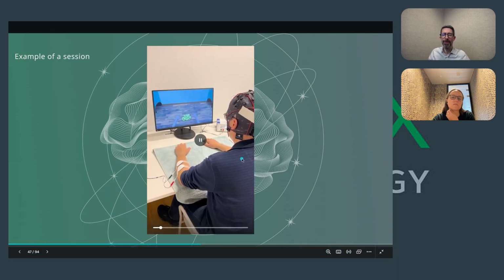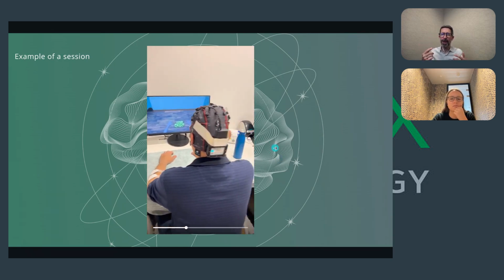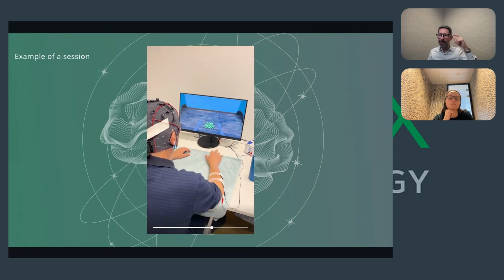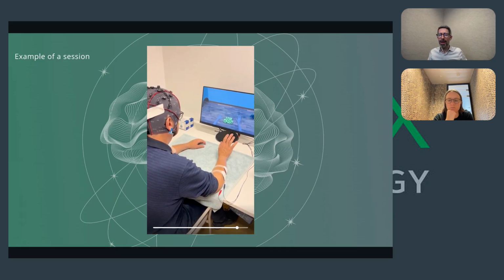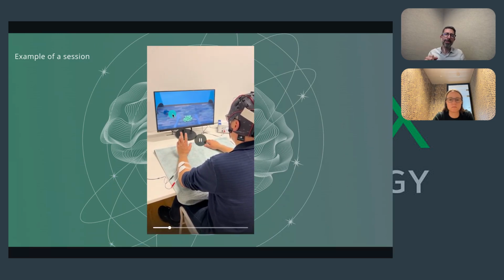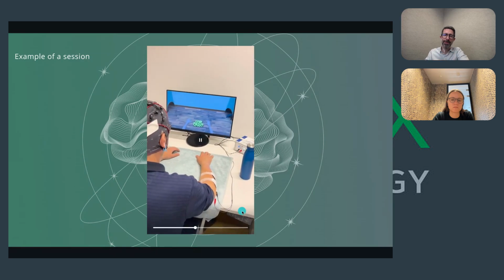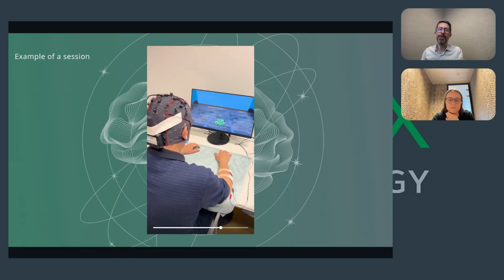When we hear left, we have a second or two of reaction time, as when we drive a car, where we're like, huh? What? Which side? What is it I'm supposed to do? I'm exaggerating. It just takes maybe a second. And while the person reflects on what they're supposed to do, and then starts to imagine the movement, the hand or the arm isn't moving yet. As soon as we pick up the signal that the person is really imagining that movement, 2 things happen. 1, on the screen, the arm goes up, and 2, there is electrical activity, an electrical current through the electrodes. It's a little bit like tickling. It's not really painful if they're well placed on the muscle. It's nothing to be afraid of.